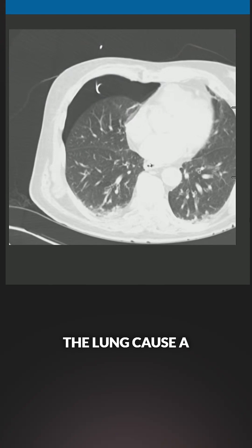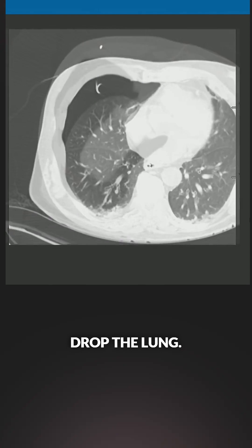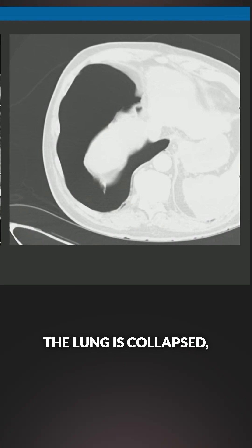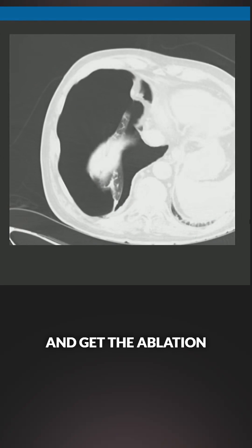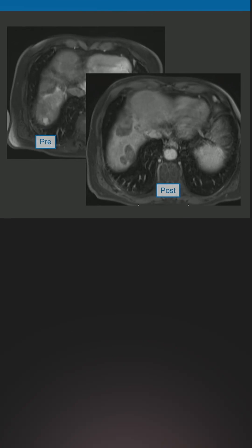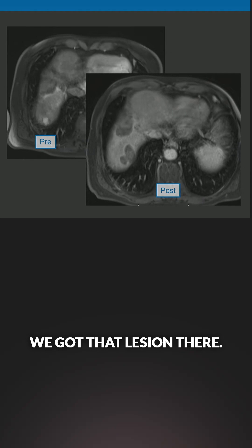What I would do is intentionally drop the lung, causing a pneumothorax — drop the lung — and you can see here now we have this path. The lung is collapsed, and we get the ablation probe into the right spot, do the ablation, re-inflate the lung, make sure it stays up. And you can see that we got that lesion there.